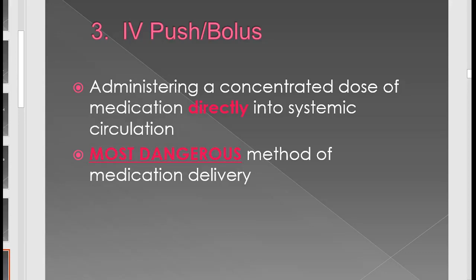An IV push is exactly what it sounds like. You're just going to directly push in the medication. But remember, once you push in medication, it's very dangerous. You cannot take it away.